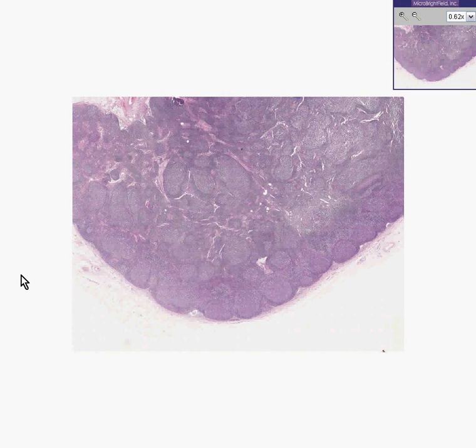In my primitive way of thinking, I guess you could say there's three kinds of lymph nodes. There's totally normal lymph nodes, which follow the classic histology textbooks. And then there's enlarged lymph nodes, and the enlargement may be because of benign, hyperplastic, or reactive changes, or they may be enlarged because they have primary or metastatic tumor.